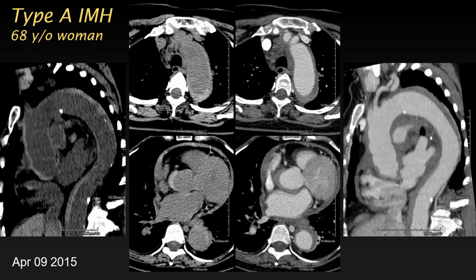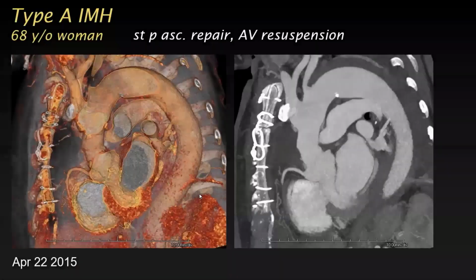If you had a rupture of the aortic wall through the adventitia, this is very hard to survive, because you have an acute tamponade of the pericardium. If you have fluid that seeps through the wall in the descending aorta or in the arch, then you will see periaortic stranding, because that fluid seeps into the periaortic soft tissue and the fat, but you won't have a pericardial fluid.